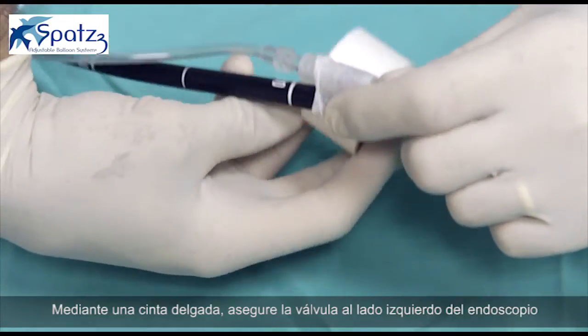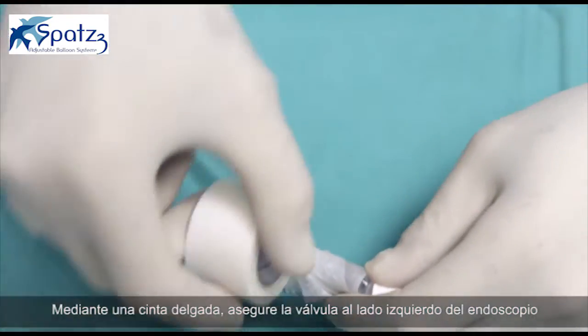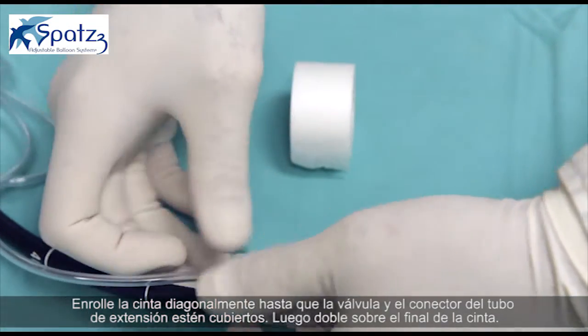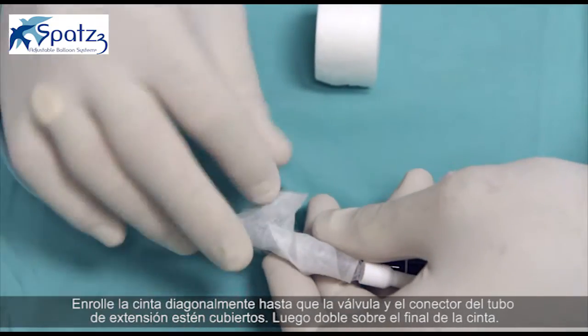Using thin paper tape, secure the valve to the left side of the scope. Roll the tape diagonally until the valve and the gripping parts of the extension tube are covered. Then double over the end of the tape.